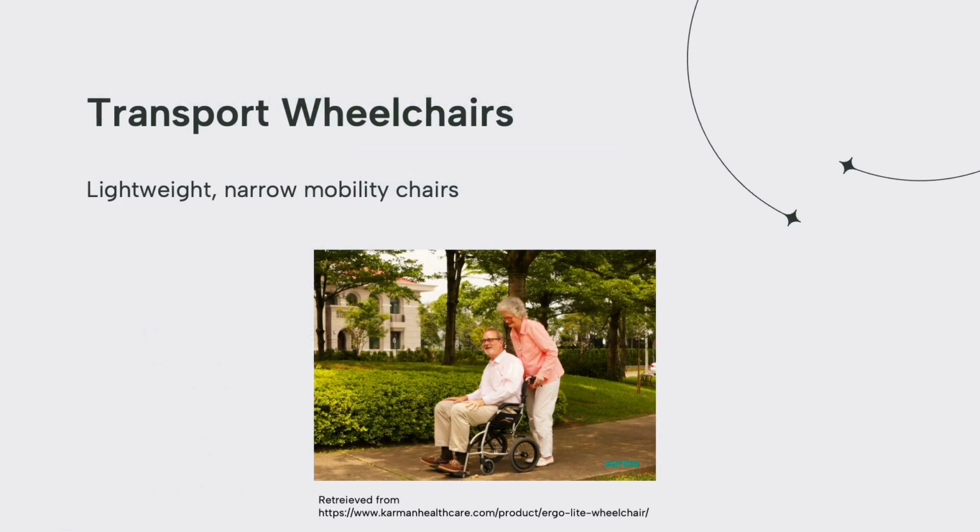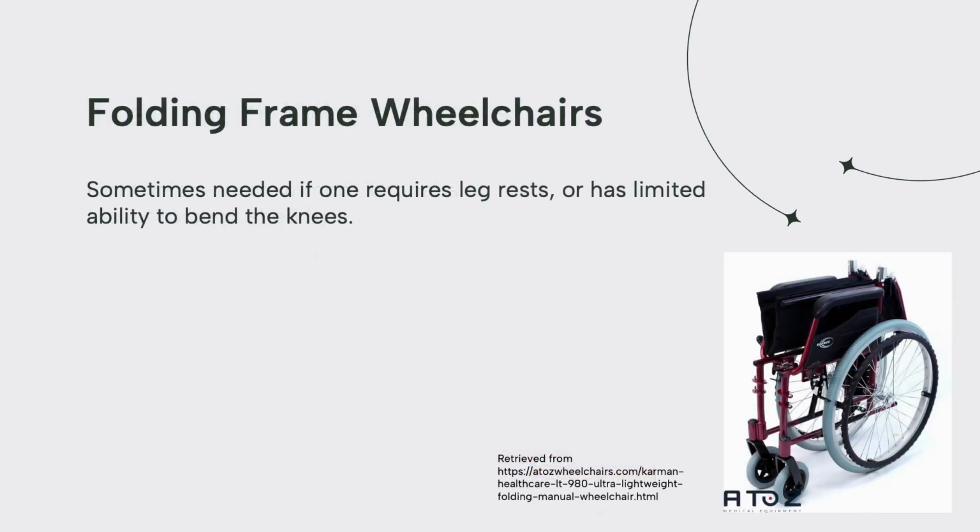Transport wheelchairs are lightweight, narrow mobility chairs that combine the function of a wheelchair with the maneuverability of a walker. They are meant to be pushed by a caregiver, as their small wheels make it impossible for the wheelchair user to propel themselves. Next, folding frame wheelchairs.